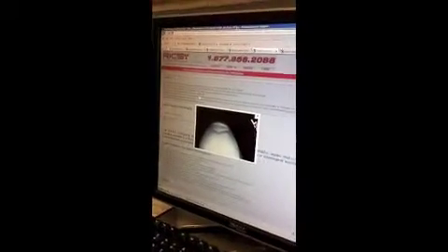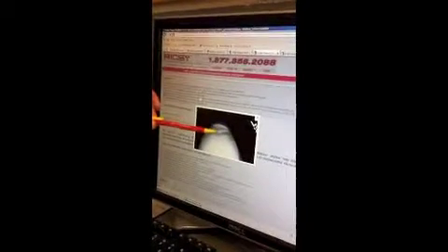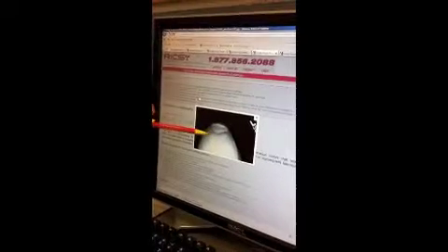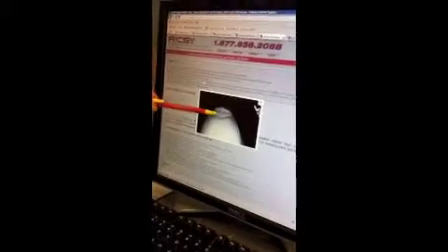For the Settegast, you want the patella in profile. You want an open patellofemoral articulation. You want to see the surfaces of the femoral condyles. You also want to see the soft tissue of the patellofemoral articulation. And you also want to see the bony detail on the patella and the femoral condyles.